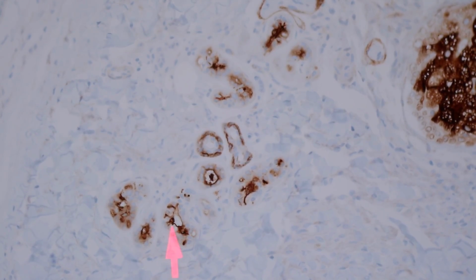And then as the gland moves into the ductal component, you begin to get some highlighting of the basal layer, the outer layer of cells as well. But this pattern right here is helpful because in some tumors that are of sweat duct origin or sweat gland origin, the lumens can be highlighted by using EMA to highlight the secretory lumens, and that can give you a clue that you might be dealing with a sweat gland tumor.